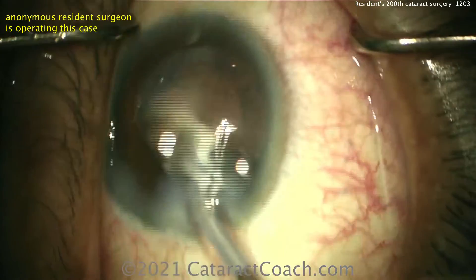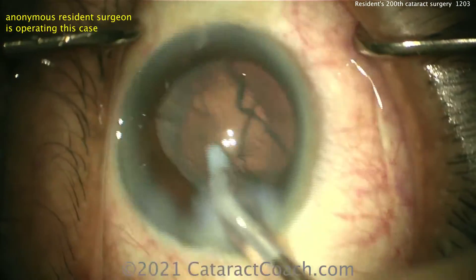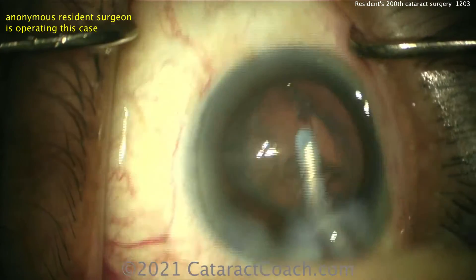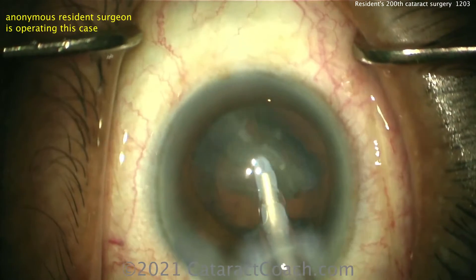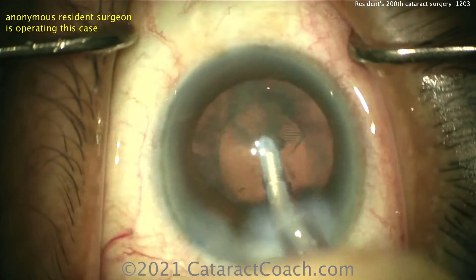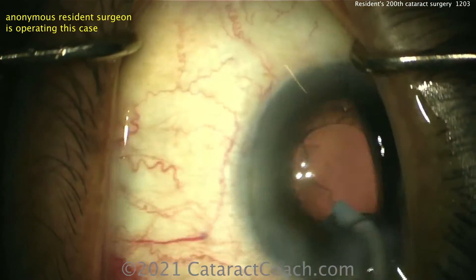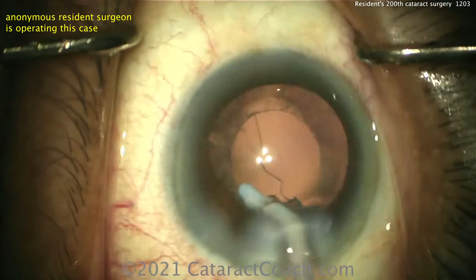Mind you, if this patient was scheduled to have another surgery very soon — like a pars plana vitrectomy with a gas bubble, or a trabeculectomy or glaucoma procedure — then maybe you'd want the smaller rhexis, so that you can ensure the IOL stays in the capsular bag despite any changes or fluctuations of pressure.